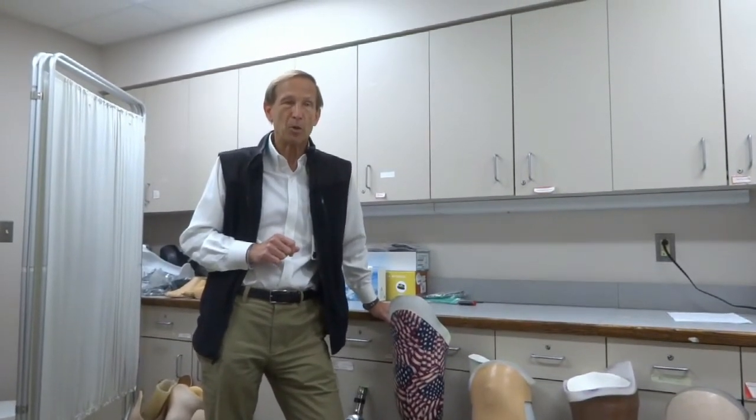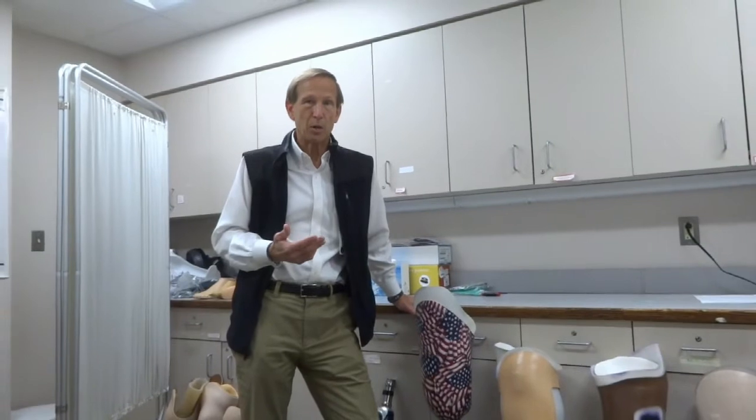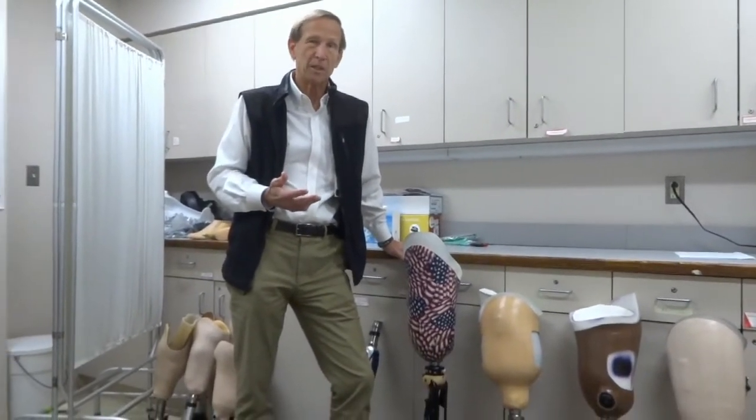If you are a category one or level one amputee, meaning you're walking mostly indoors on a level surface, then your demands for the knee are going to be relatively low. You'll walk at a slower speed — we call that fixed cadence — meaning the leg swings at one set speed, usually slower. For people that are a little older or more disabled, they want something much lighter. Category one knees are typically very light, very simple to use — low performance, but very safe and very stable.